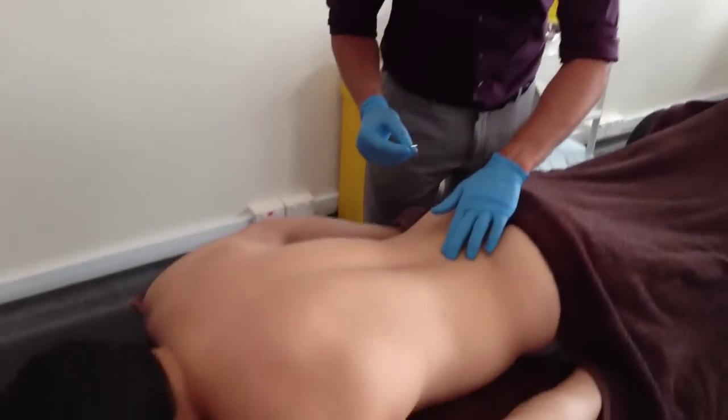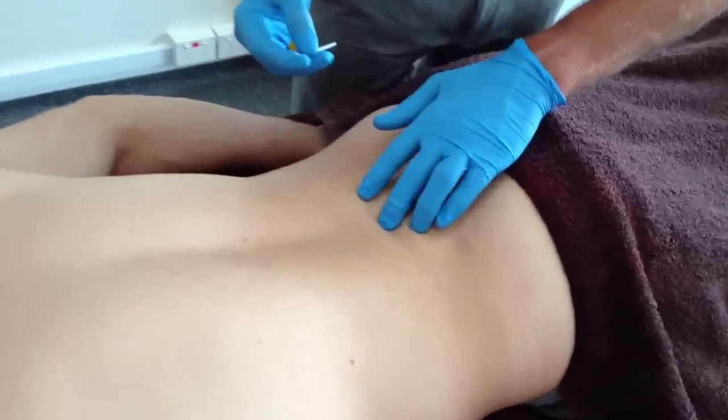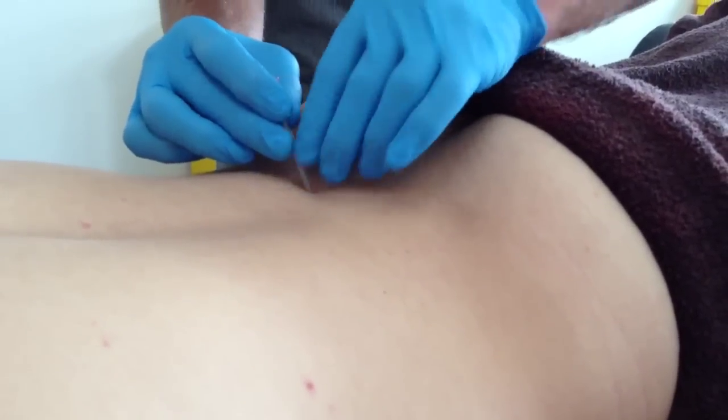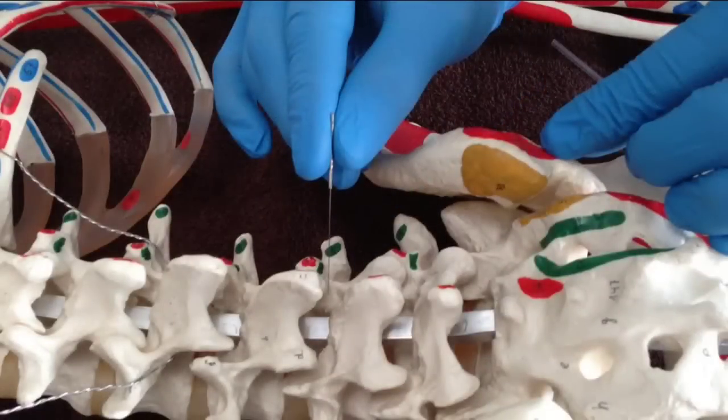With a patient in the prone position, the practitioner is feeling between the spinous and transverse processes. A 10-30mm needle is used at a medial oblique angle towards the multifidi in the paraspinal gutter or laminar groove.